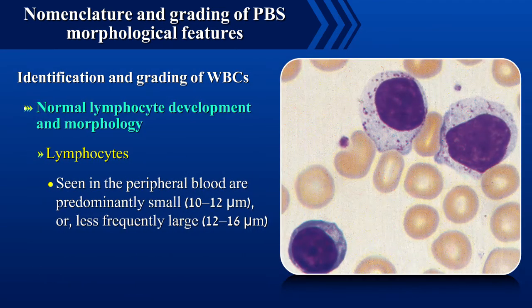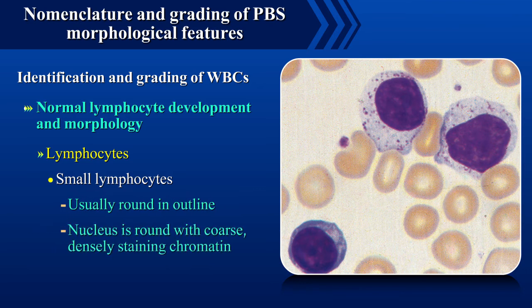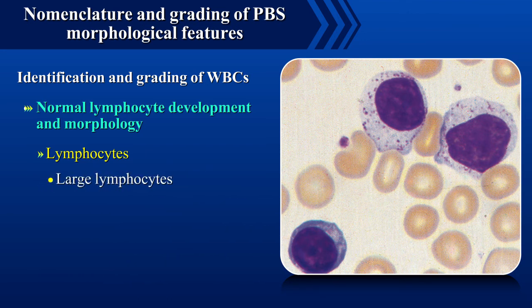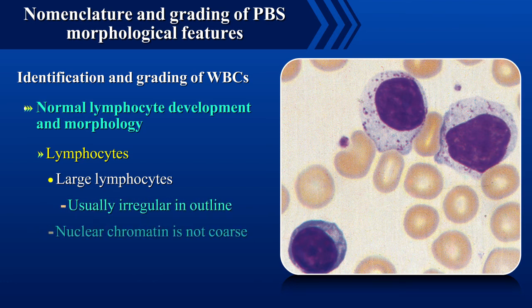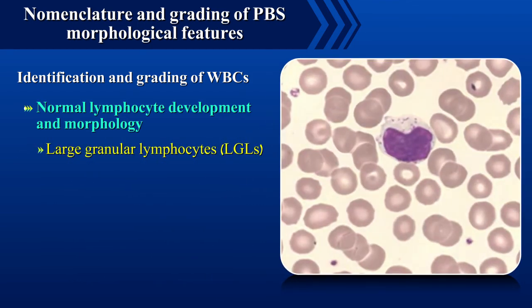Lymphocytes seen in the peripheral blood are predominantly small, about 10 to 12 microns, or less frequently large, 12 to 16 microns. Small lymphocytes are usually round in outline and the nucleus is round with coarse densely staining chromatin and scanty cytoplasm. Large lymphocytes are usually irregular in outline, the nuclear chromatin is not as coarse, and cytoplasm is abundant and tends to be light sky blue in color.